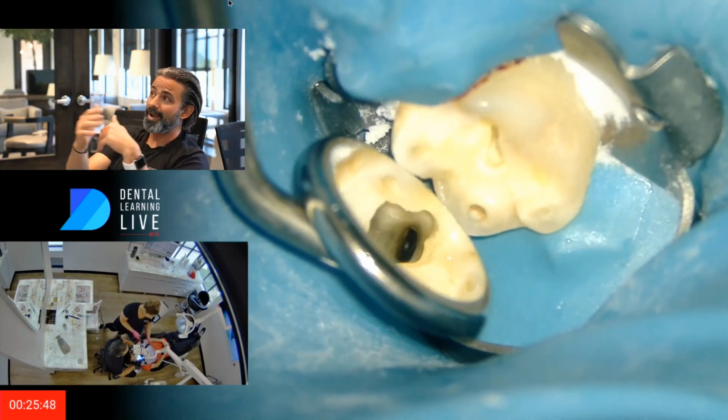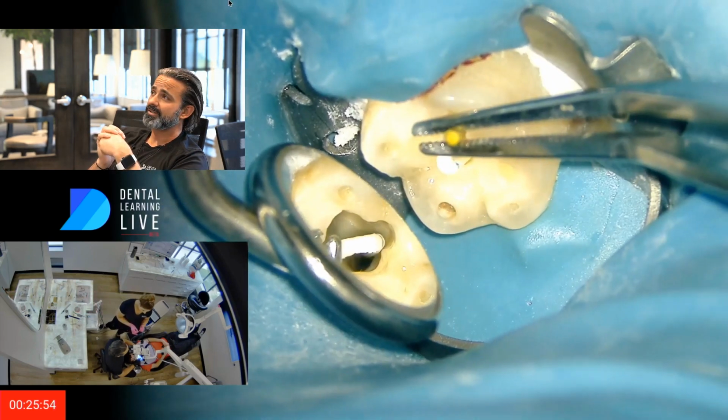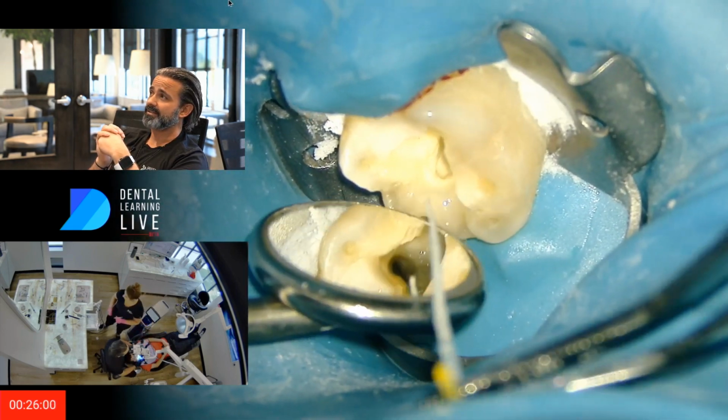Now, like I said, go back and look at the distal space and then look at it now as I dry it and wick out the fluids in there. How clean that is. It's just pristine. It's fantastic. Love it.